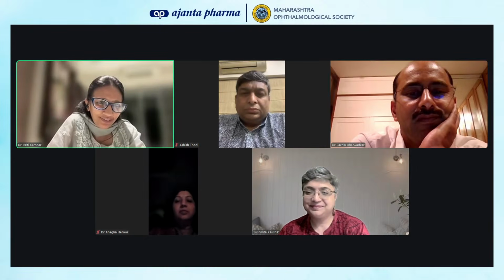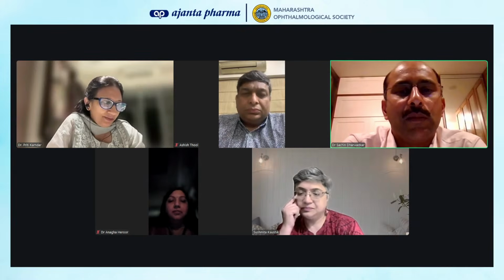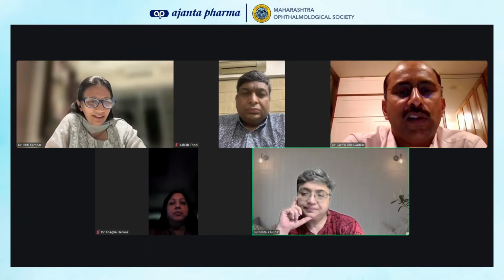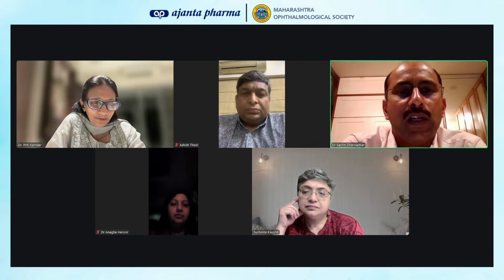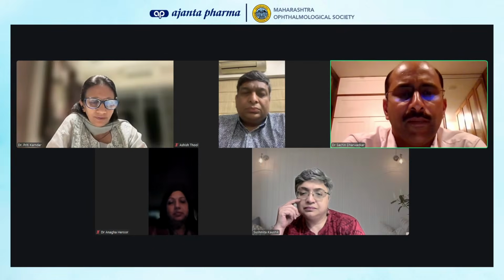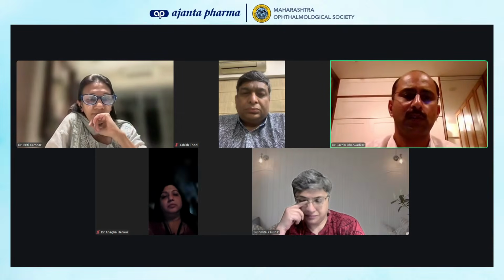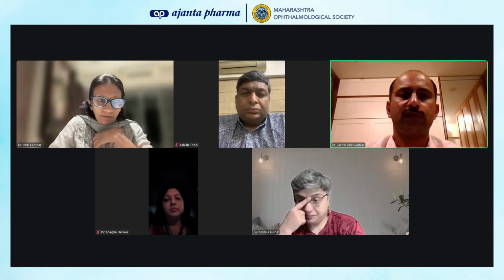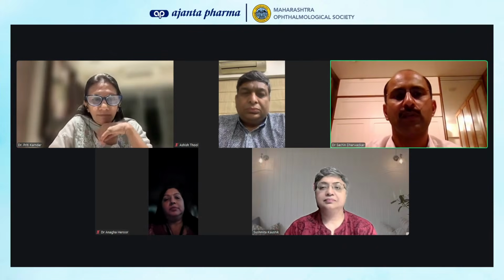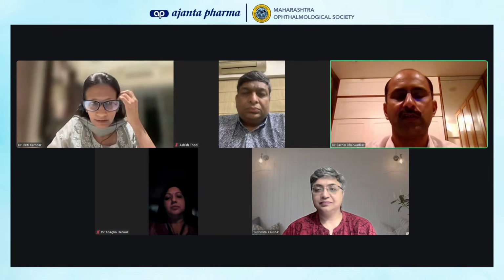Dr. Sachin. Yeah, basically it's the reverse way. You have to actually expect where the damage is and then look at the OCT. So you already should have a picture of the clinical judgment in your mind, and then you should clinically correlate. Secondly, correlation should always be there. Without correlation, there is no using investigations blindly. So that's very important. Secondly, if you are using it for things like progression, then you better be proficient at using the machine, because without that, a lot of wrong errors in treatment can occur. So you should exactly know what you're doing if you're using it for progression. Otherwise, just as a screening test is fine.